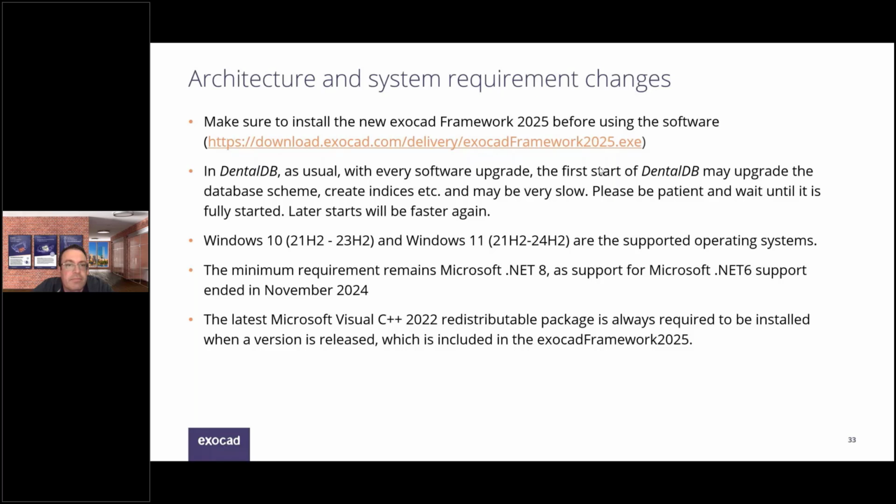Yeah, and Lucas, to add on to that, on the initial email that was sent out on the 10th of July, there should be a link where you can select to see all the new features, and that'll bring you to the PowerPoint that also has that information for the framework. Yeah, good point. So you can get to the link through that PowerPoint, and download the software. So check your email if you haven't installed the public prototype yet.